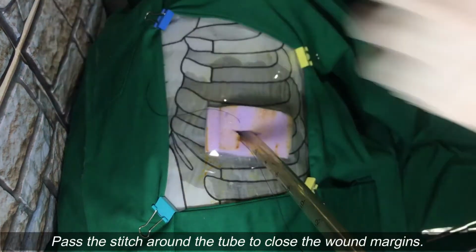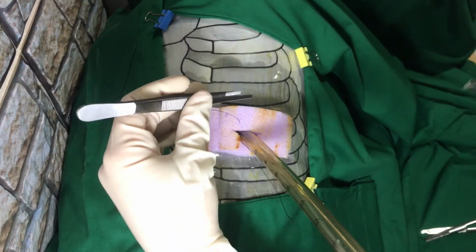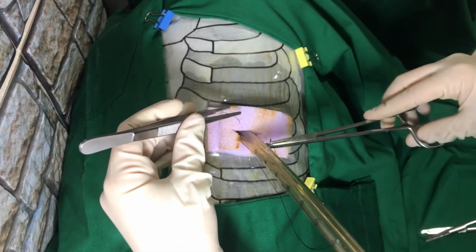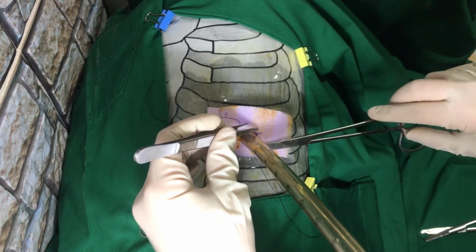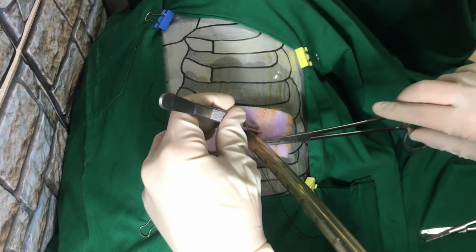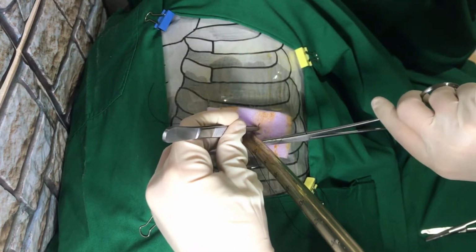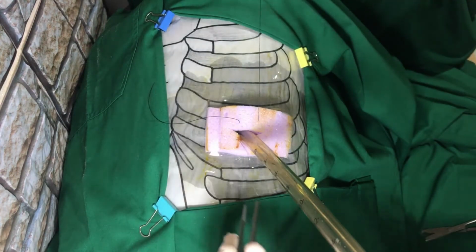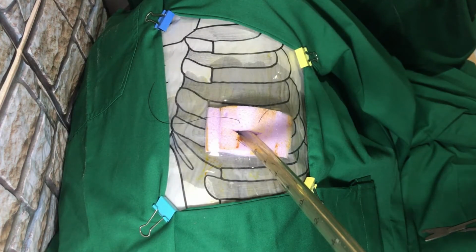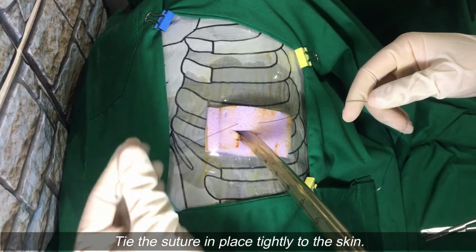Pass the stitch around the tube to close the wound margins. Tie the suture in place tightly to the skin.